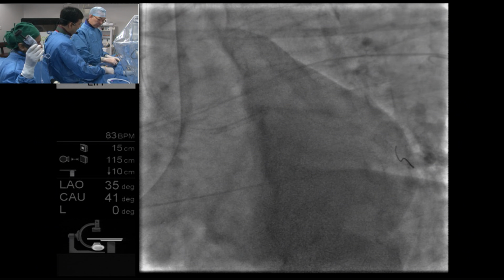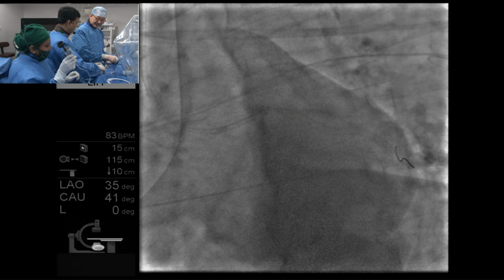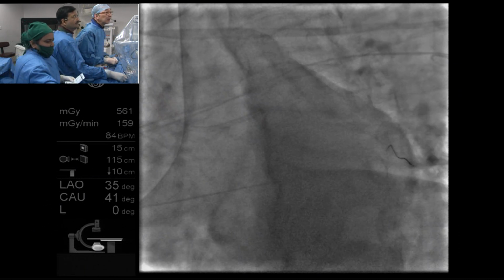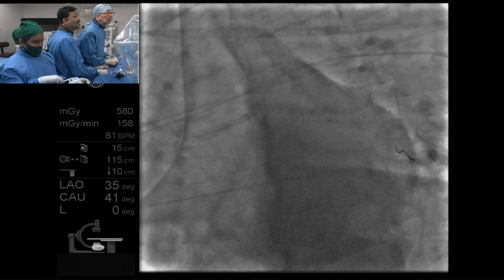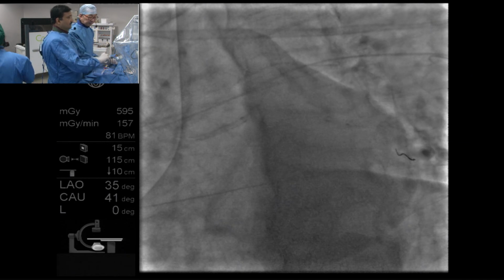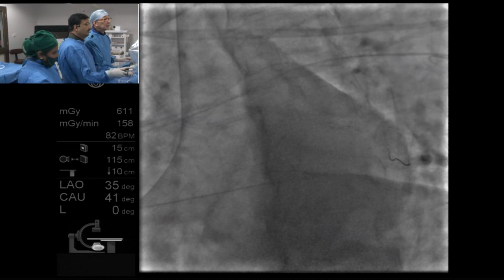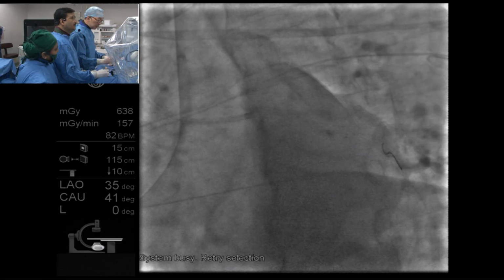You guys see how Sanjay put the wire in the balloon? He's using the scoop technique. So the only area is the proximal to mid area, I think a short area. Should be here. Yeah, there's a lot of wire bias there. Proximally. Go. Then I'll pull back one more leg. Go. High, high, 15, high, high. 20, 20. Down. Okay, 20 down.